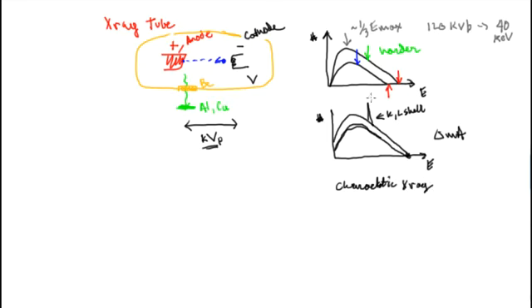You see extra emission at a particular energy corresponding to the K shell transition in whatever metal you're using. They actually use that in mammography. They'll use the K and L shell photons to do imaging, because you get essentially a monoenergetic beam, which allows you to reject scatter and so on, and get better image quality.